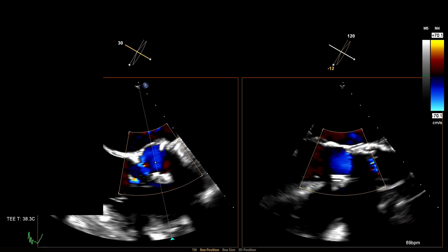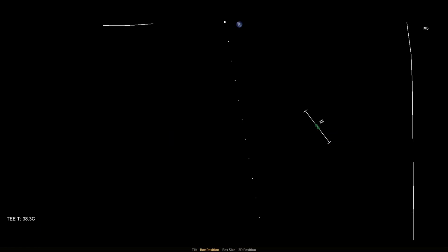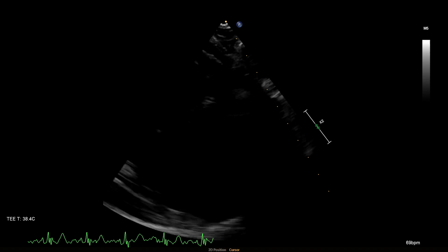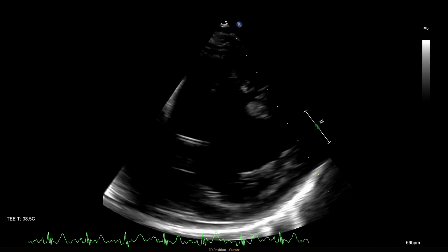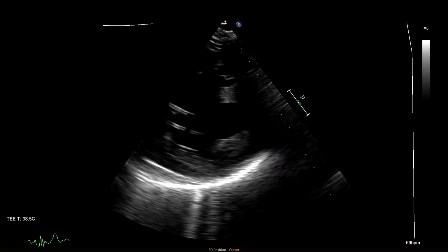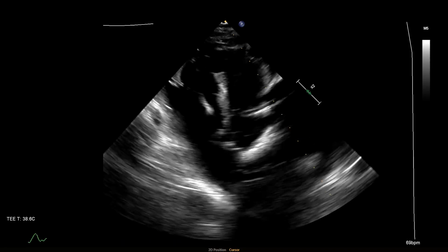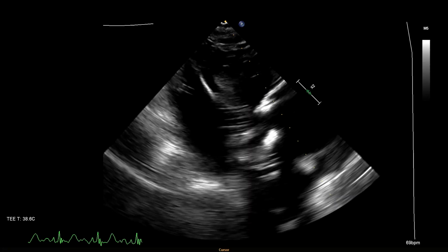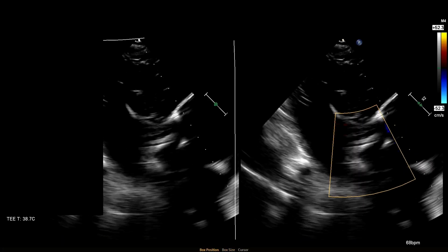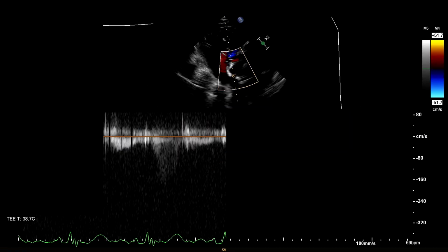Very nice, beautiful. So again, there's a lot of debate from the SMART trial about invasive versus echo gradients. And at least from the hemodynamic standpoint, with very good blood pressure, there was no invasive gradient. So time will tell. This patient is going to be followed up, obviously, as part of the Apollo trial, at least 5 years out, and we'll look at both the aortic and the mitral valve to see what will happen in the long run. And an arch angiogram, post-arch angiogram? Yeah, do an aortogram.